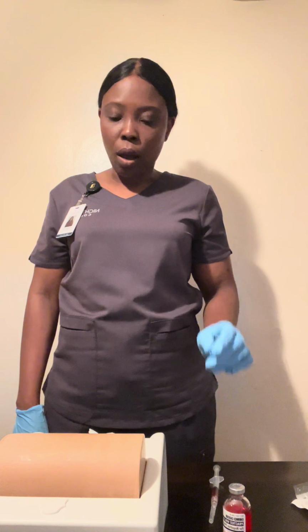Okay, and then now I'm gonna use my non-dominant hand to hold the skin nice and tight while I administer the medication.